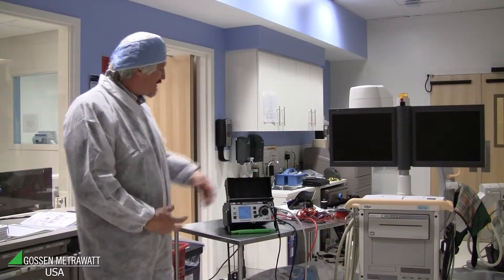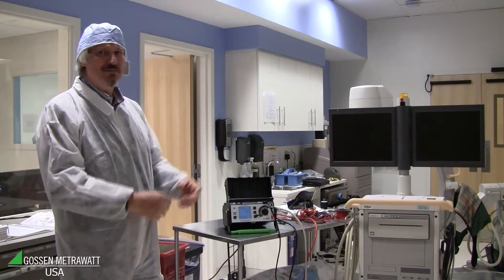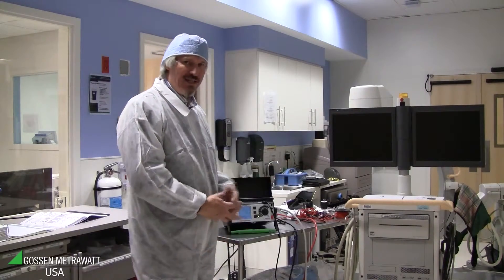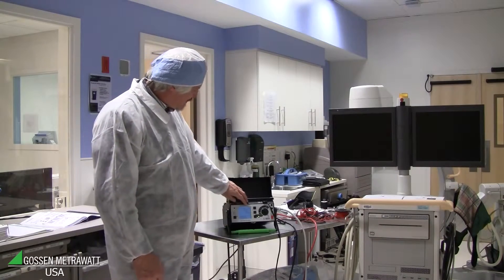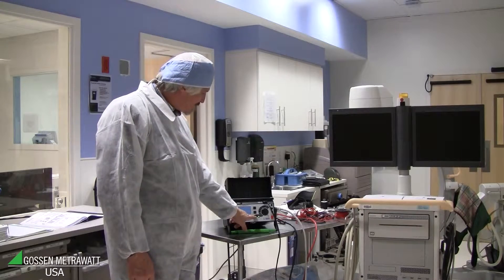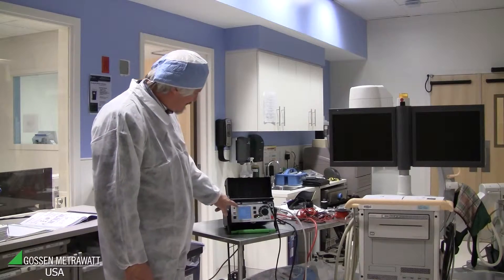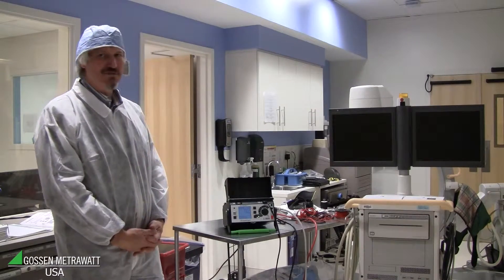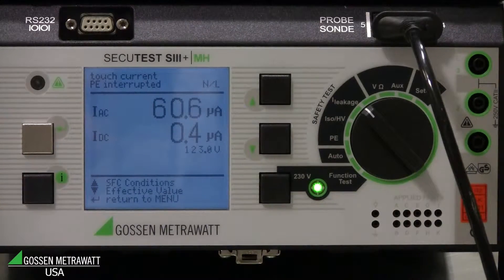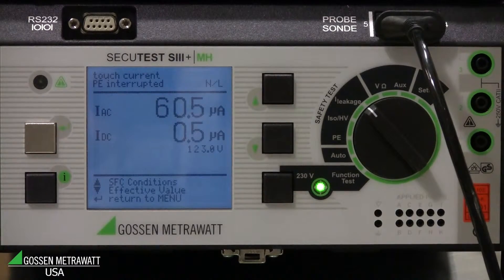For mobile X-ray equipment it's possible that live and neutral are reversed, so you must repeat the measurement with polarity changed. You don't need to disconnect and reconnect — the tester can change the polarity by itself. Just push the button where the green light is, switch the equipment off and on again, and polarity is changed. In this case the current is quite the same at 60 microamps — still safe and well below the allowable values.